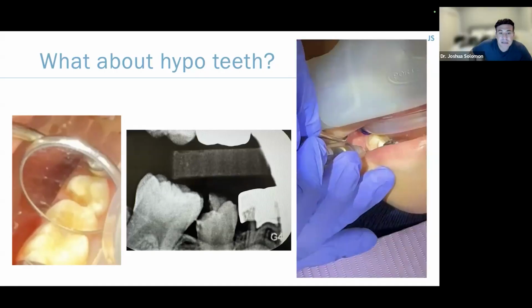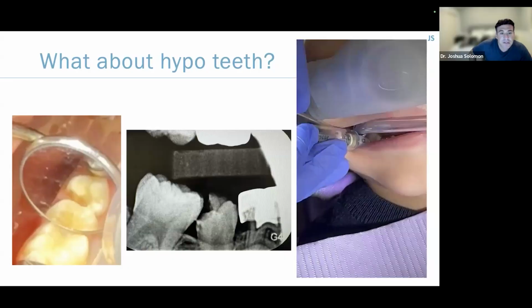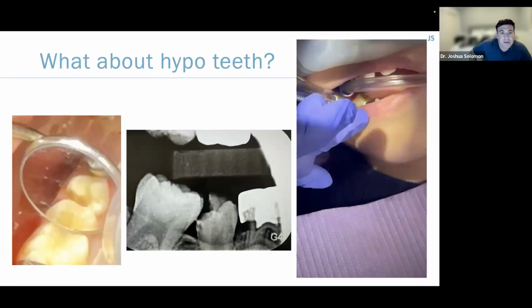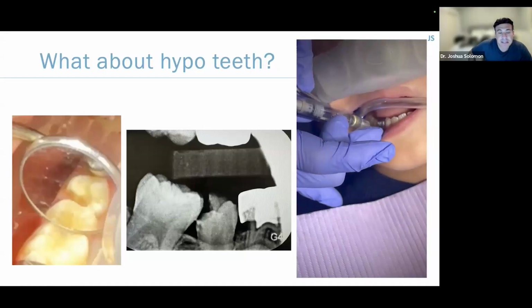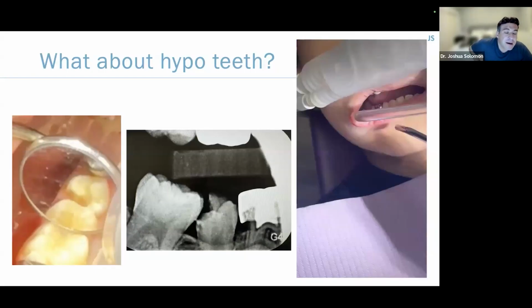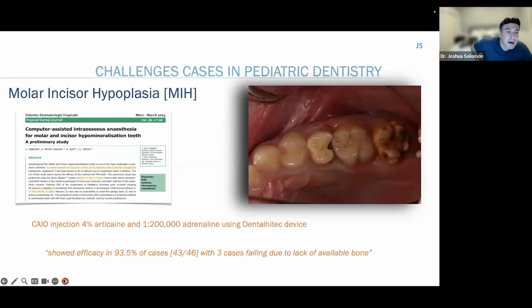Stage 1, great orientation, straight through, a little rotation if needed. Check our lights. If you have a hypo 6 or another hypoplastic permanent tooth, I would definitely recommend giving a half carp. And if you need to get a rubber dam on, you're really concerned about it, you may want to bump that up to 3/4. But let's talk about why. Beautiful.